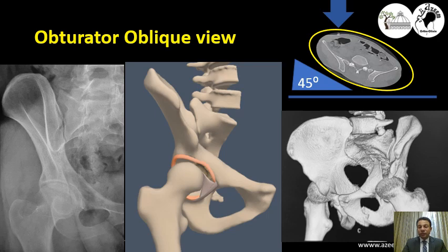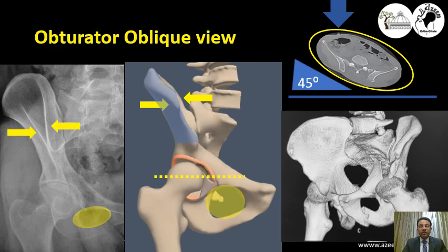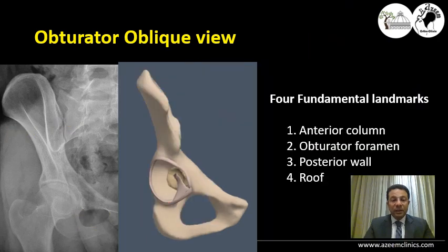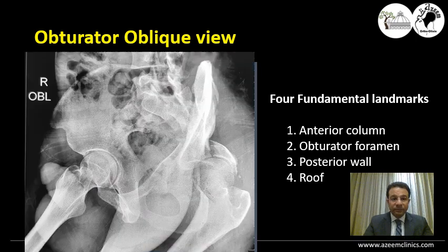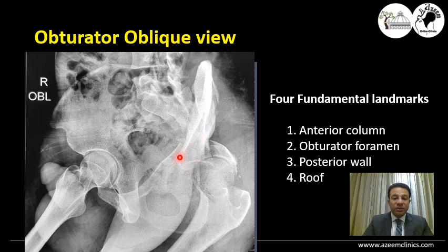The obturator oblique view is done by turning the patient 45 degrees internally. The best view is identified radiographically by having the anterior superior and posterior superior iliac spines at the same point, showing the largest possible portion of the obturator foramen. On the obturator oblique view, four fundamental landmarks can be identified: the anterior column, the obturator foramen, the posterior wall, and the anterior part of the roof. This is an obturator oblique view of a patient showing a fracture of the posterior wall and a transverse fracture with a discontinuity of the anterior column.